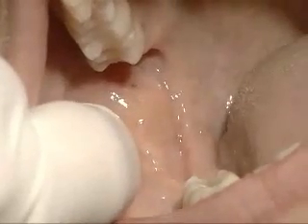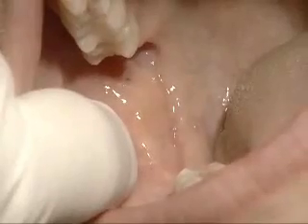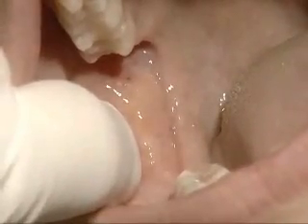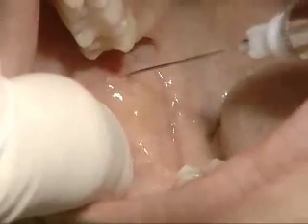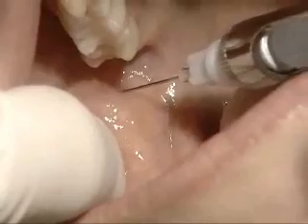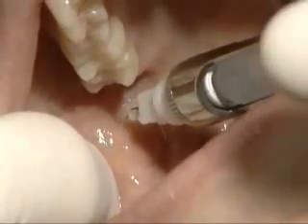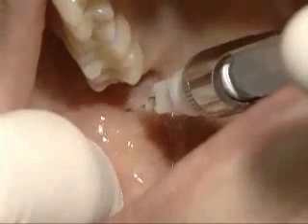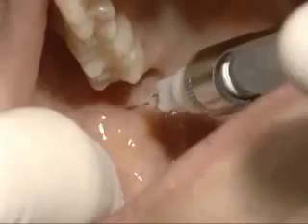Penetration is also reduced by the retraction of soft tissue such that the mucosa is taut. With all the mandibular techniques, it is preferable to use a 25 gauge long needle. The 25 gauge is preferable to the narrower gauges for two reasons. You cannot differentiate among the 25, 27, or 30 gauge, so there is no advantage in using the narrower gauges.